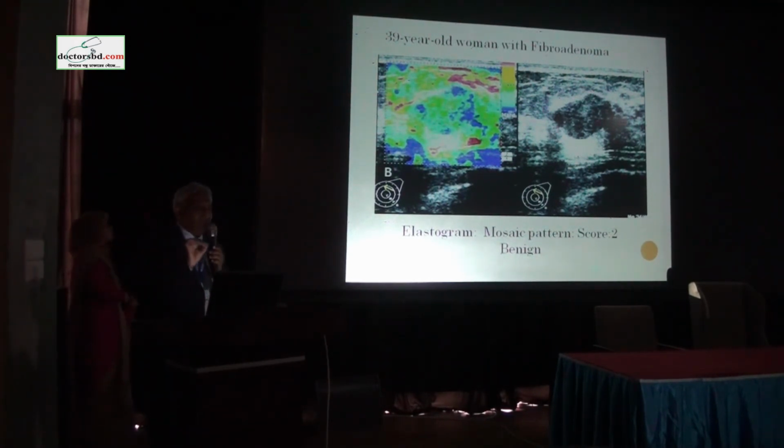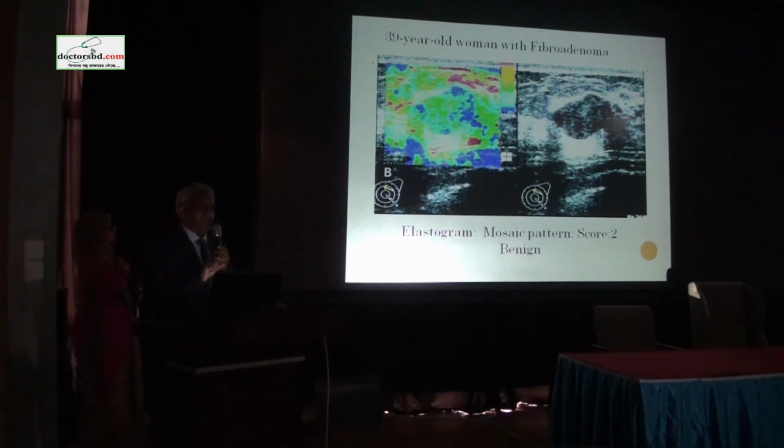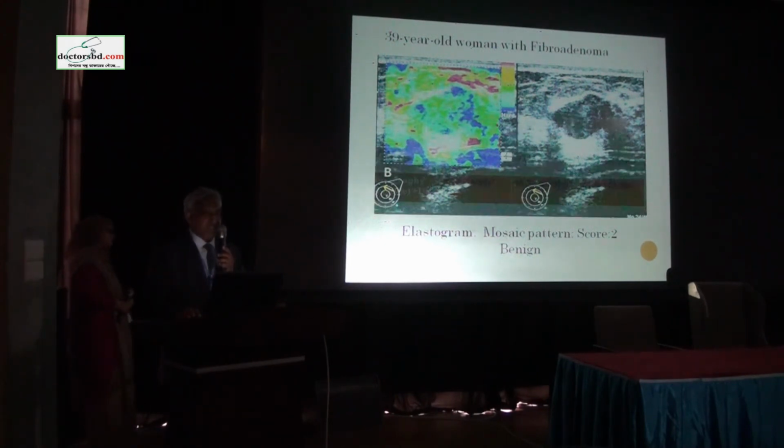Another lesion over here, you see the very well-defined, smoothly marginated, no infiltration, no lobulation, no irregularity, and no calcification at all. And definitely on the basis of ultrasound, you will label it as grade 2, score 2, and BIRADS 2. And on the elastogram, you find a mix of color, a kind of mosaic pattern, which is commonly seen in cases of BIRADS 2 category, a case of fibroadenoma.